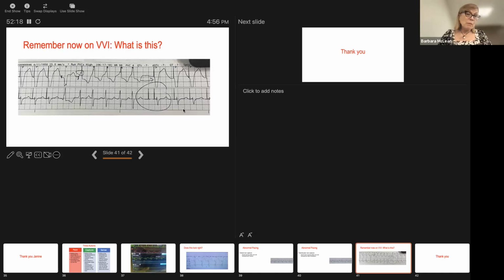This is obvious pacemaker failure, but we're not sure what the failure is because we can't actually test it. And so I'm going to call EP. They may say, I'm not sure either. I'm going to have to test it. I'm positive they're going to say, here, you've got spike, fusion, spike, fusion, spike, fusion, pause. And that's a failure here. This is a little bit of a failure. And then you have another spike.